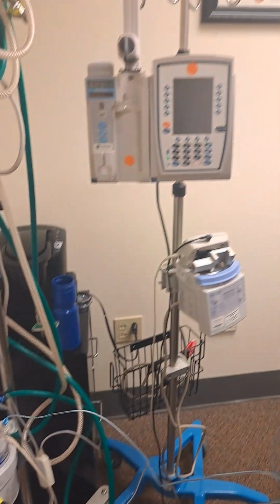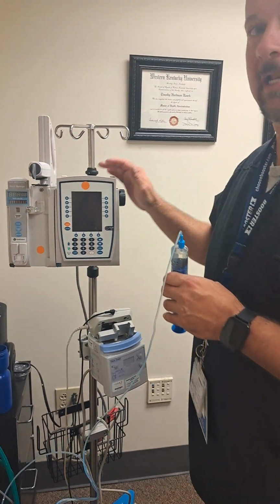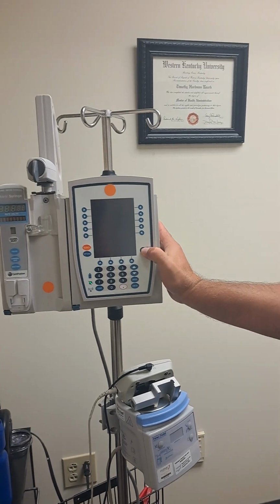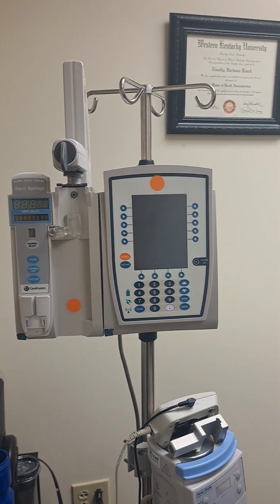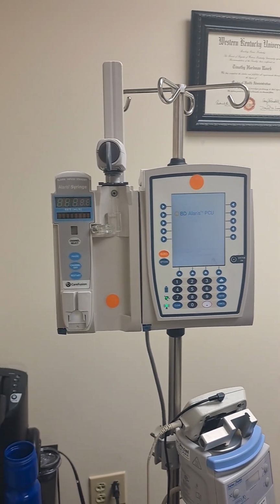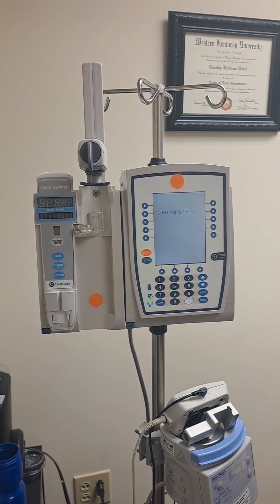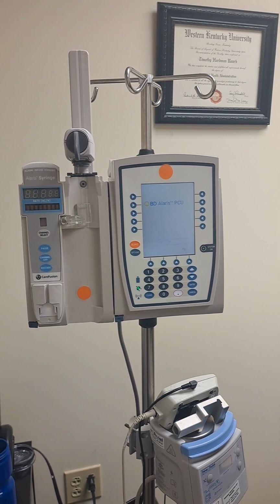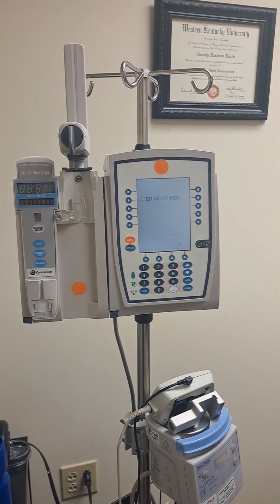All right. Now it's time to go over the Alaris pump. We'll hit the system on button to give it time to turn on. And while it's coming on, there's three types of equipment that we will use this on. We use it on a ventilator for an intubated patient. We use it on a ventilator for non-invasive ventilated patients, and we also use it for high flow patients.